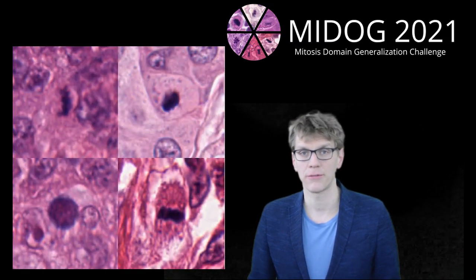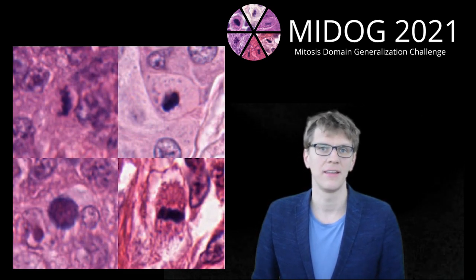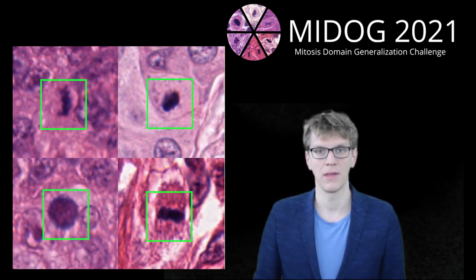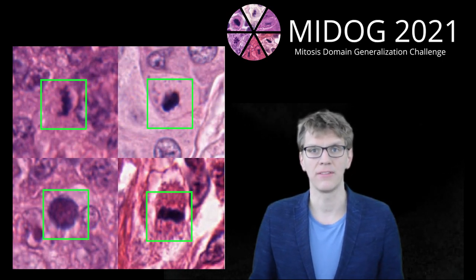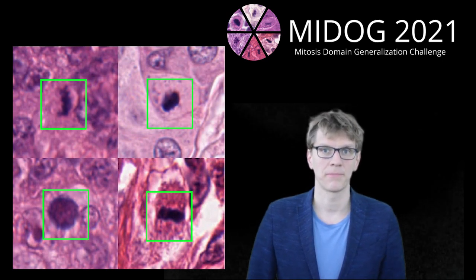Now, if mitotic figures are that important, then of course the question is, why don't we apply some deep learning to it so that we can facilitate the workflow of the pathologist and with that maybe even have an increase in accuracy, which would of course benefit the patient.